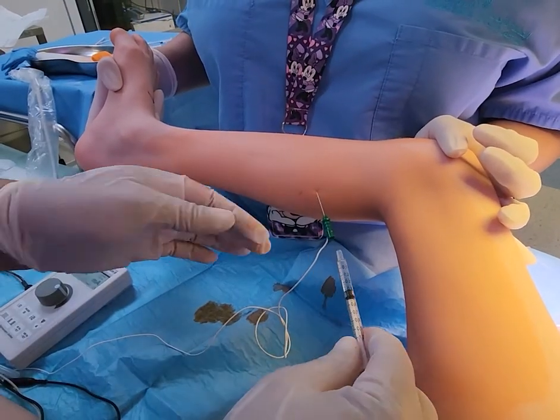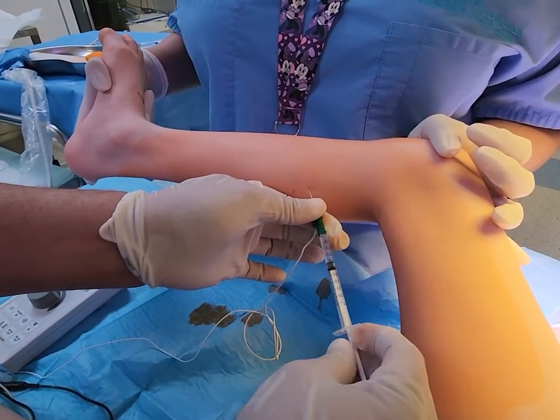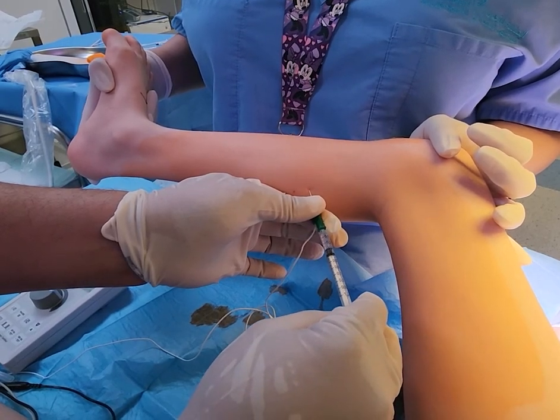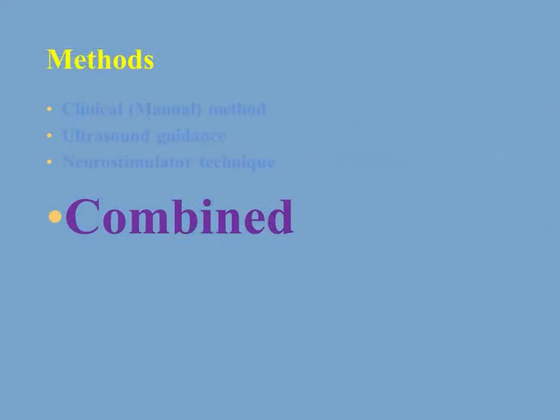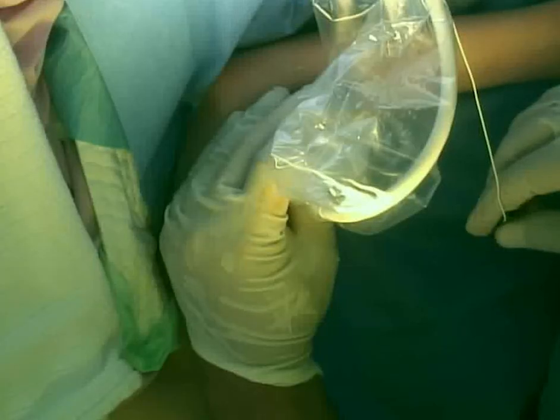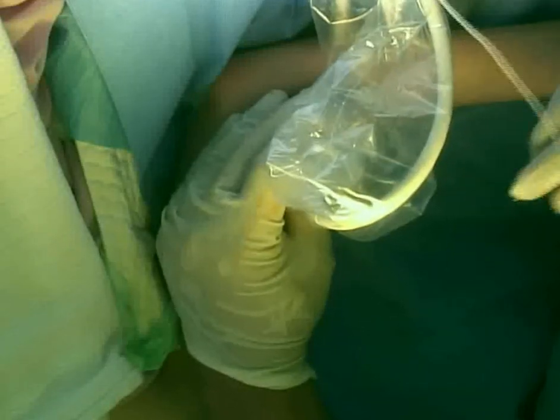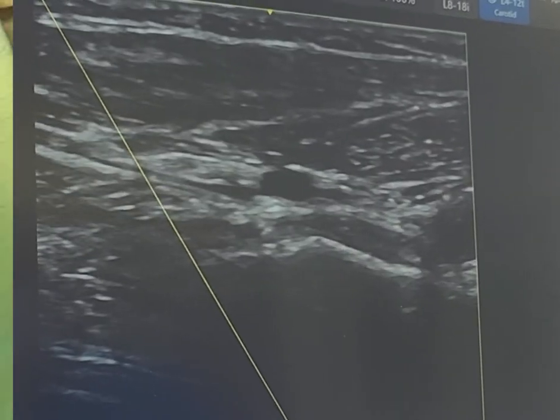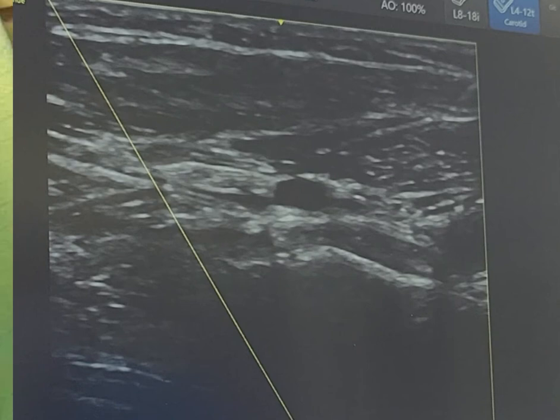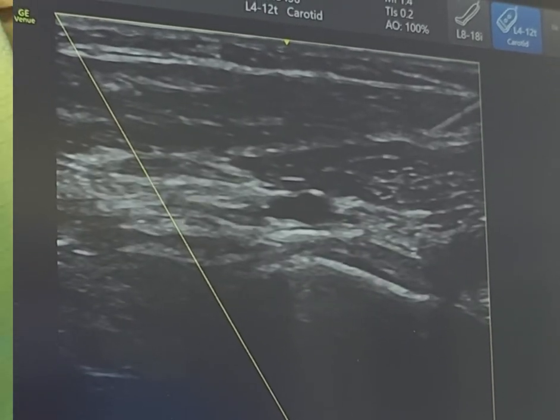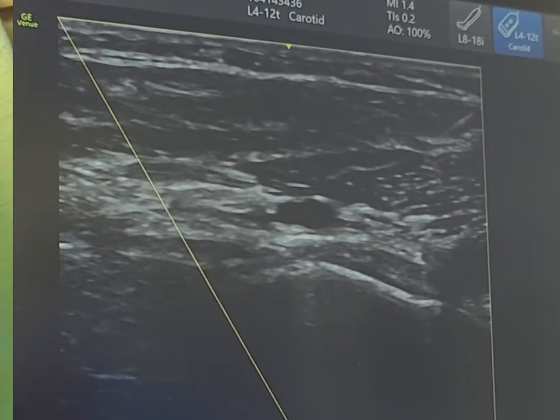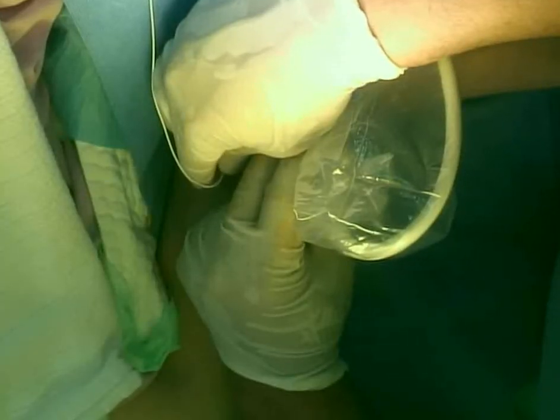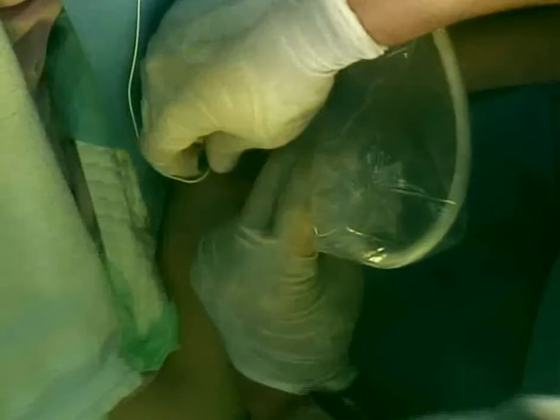We stop the device, hold the needle very tight so we don't advance it deeper by mistake, and inject the botox. This brings us to the combined method, in which we combine all these methods to achieve accuracy. The common application is the forearm muscles. Here I'm trying to inject the flexor digitorum profundus in a child with long flexor tightness. I identify the muscle both clinically and by ultrasound, then advance the neurostimulator needle into the muscle and check it electrically.